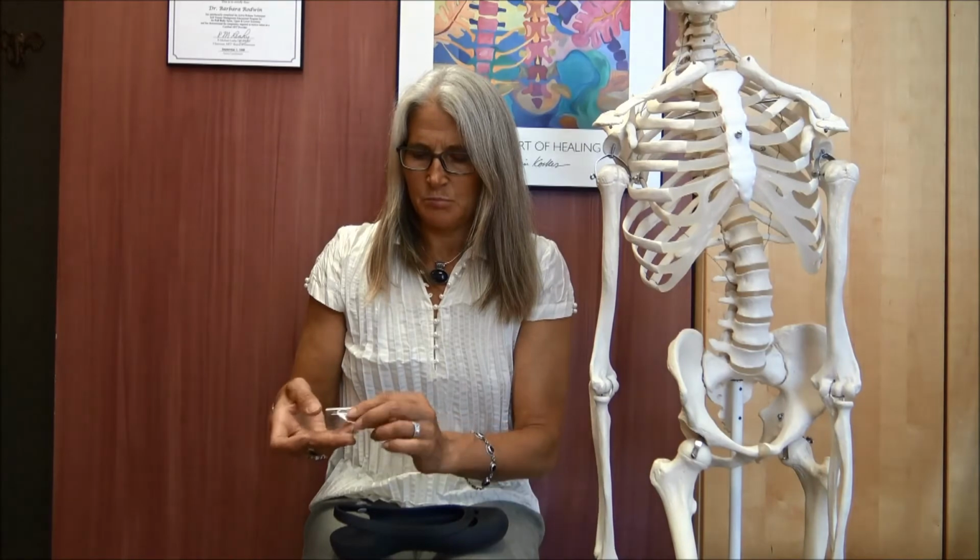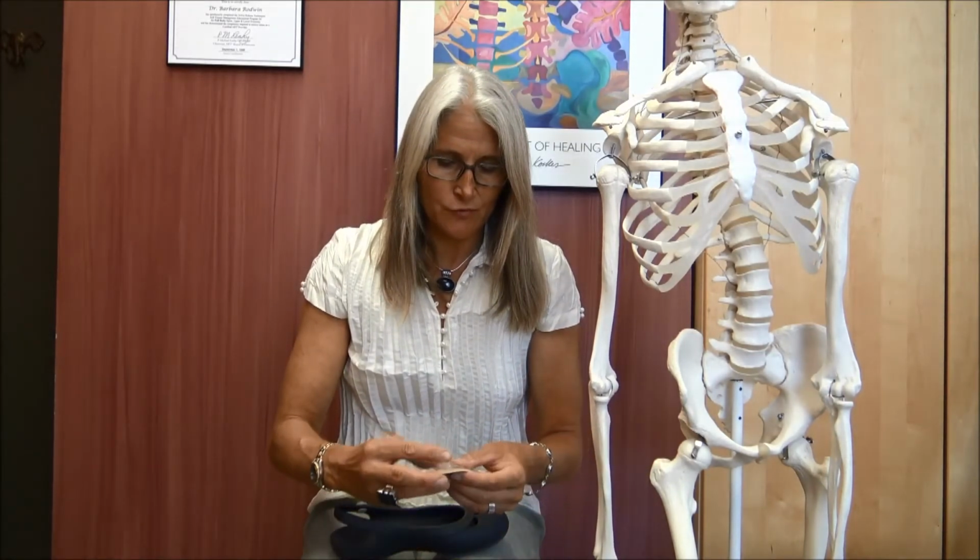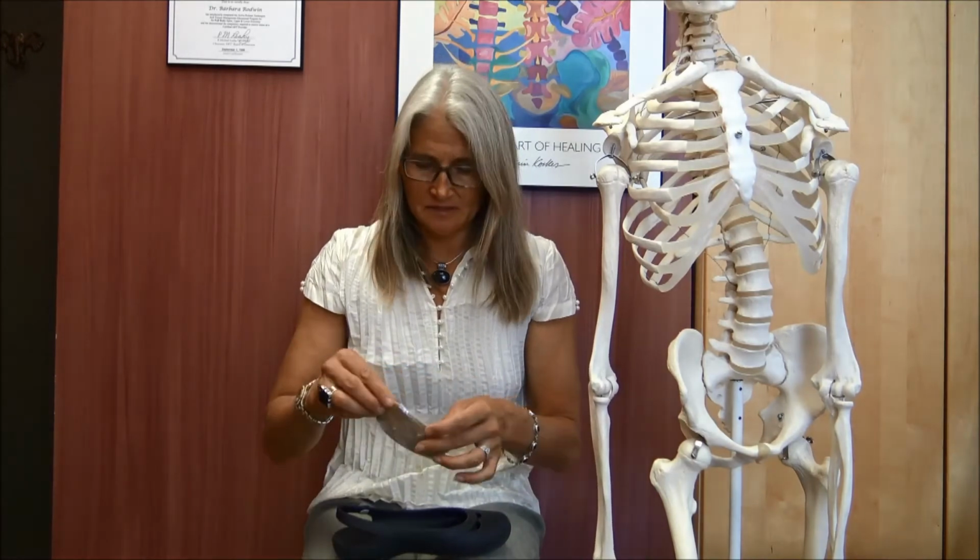Now I have had a patient use duct tape once. I don't recommend that because it does ruin the bottom of your shoe trying to take the heel lift out. So I do recommend the clear packing tape. I have had patients ask me, should I use Velcro? The only issue with the Velcro is it does add height. With the clear packing tape, it doesn't add height because you can see I've covered the whole bottom.